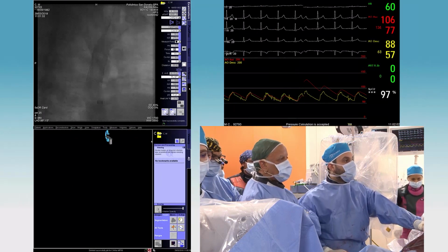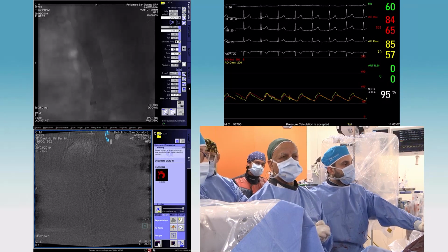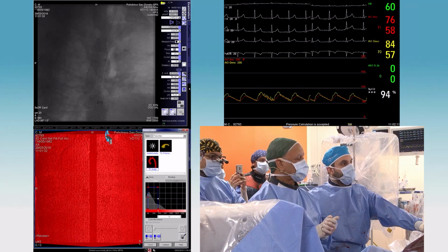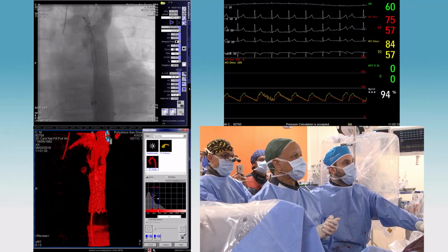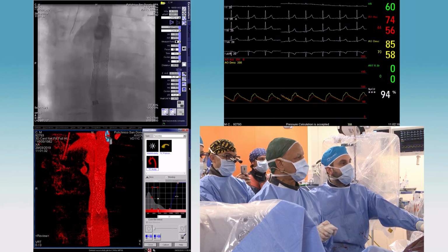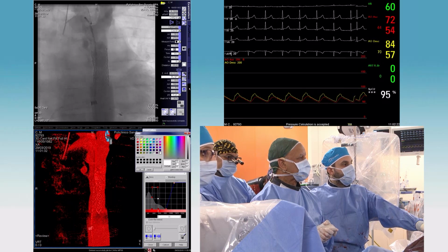Okay, all right, so let's do a quick reconstruction and then the program can continue and we're done, I think. What do you think? There's a 3D rotational angiogram being reconstructed, but the one that you're seeing, any thoughts on that so far? It looks all right to me. Yes, it looks very nice.